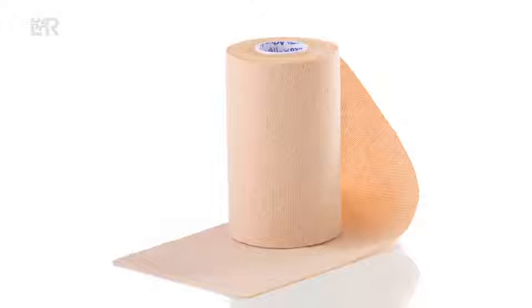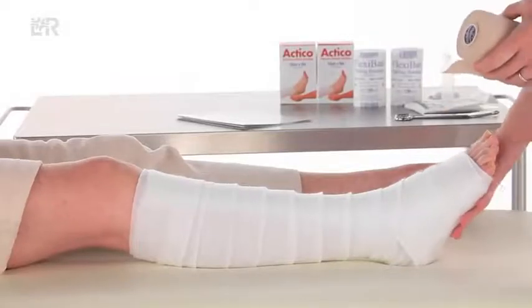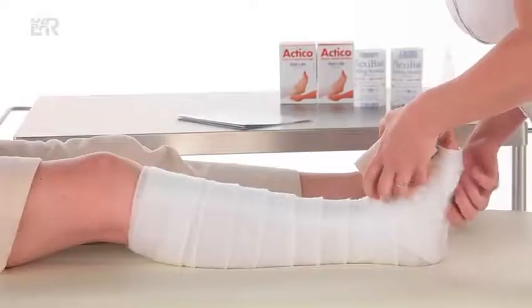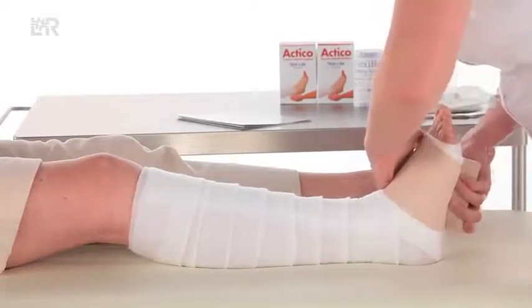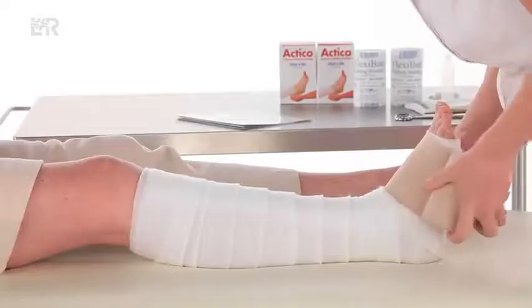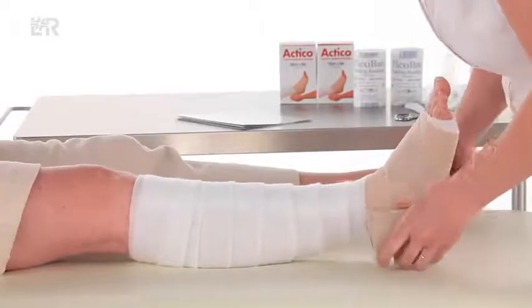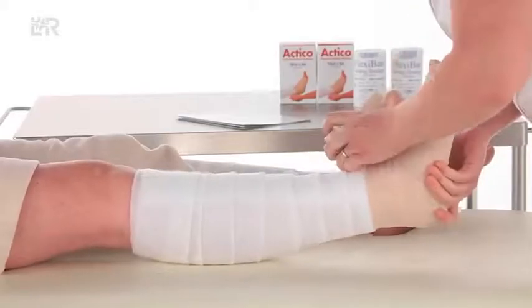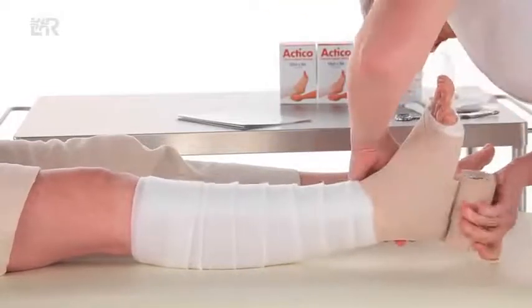Before applying the Actico 10 centimetre bandage, check that the foot is correctly positioned toes-to-nose to maximise ankle movement. Hold Actico with tension and apply two turns from the base of the toes. Roll Actico across the dorsum of the foot, keeping tension. An extra turn may be applied in the middle of a long foot. Enclose the ankle and heel with a figure of eight.